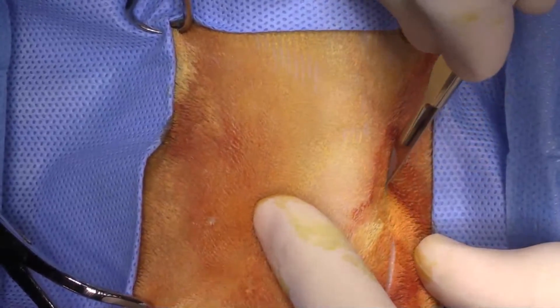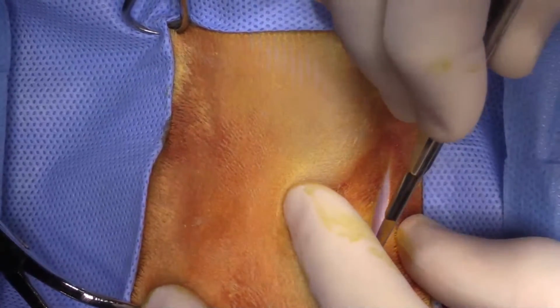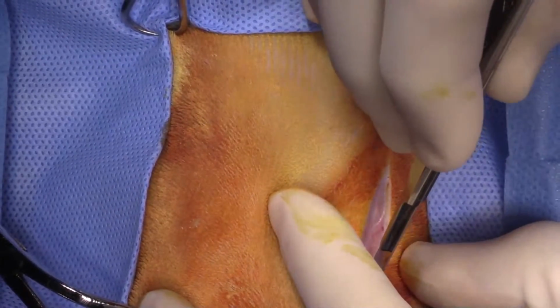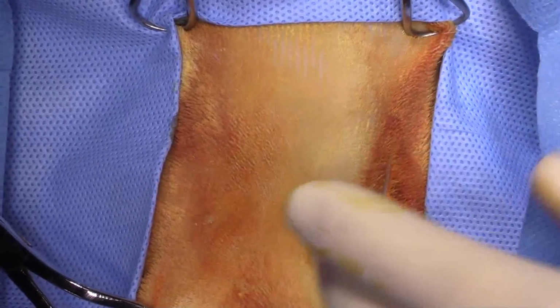There are a few structures that we will encounter on the way. The linguofacial vein will be lateral to our incision.